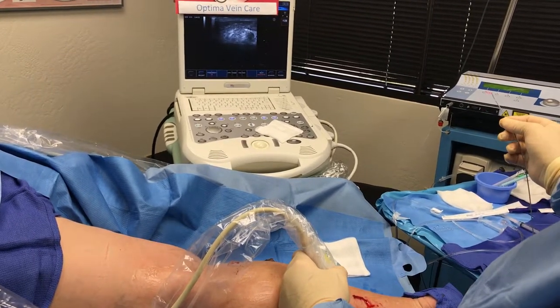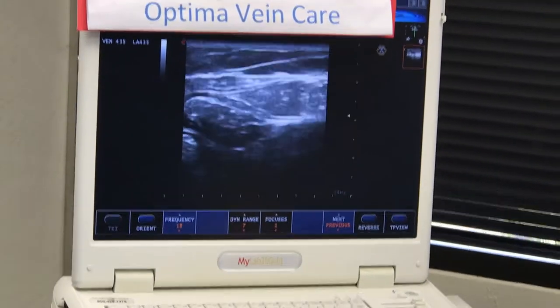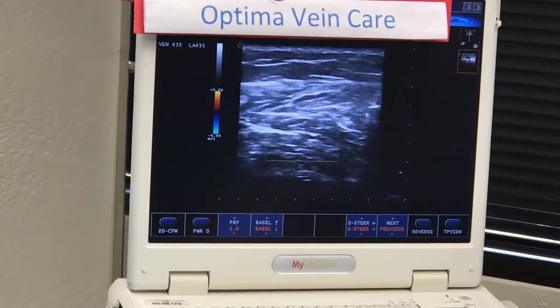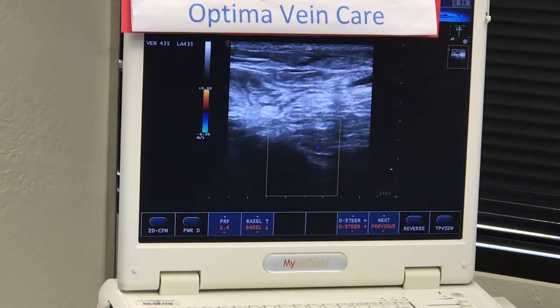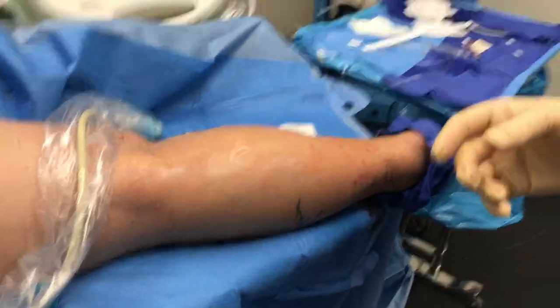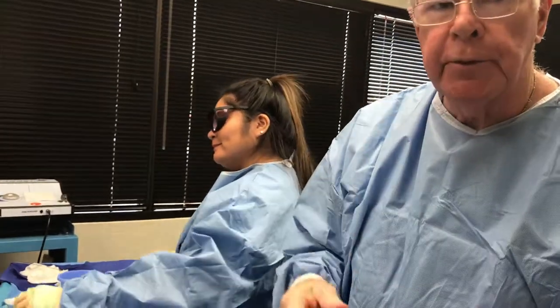I'm trying to turn the laser off just as you're coming out through the skin so you don't burn the skin too much. We'll just have a look up here and make sure the popliteal vein is open and functioning. With the color on, there's the popliteal vein which is flashing — the procedure is done. We'll clean it up and put on a compression bandage and compression hose for about 24 hours, then take the bandage off and keep the hose for about three to five days. The patient should get a lot of benefit from this.